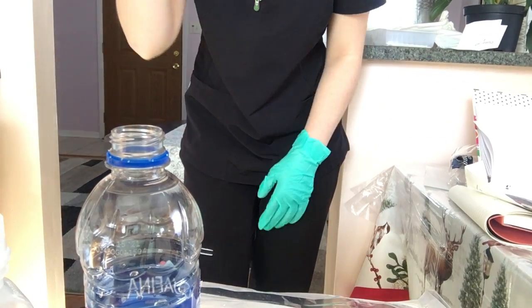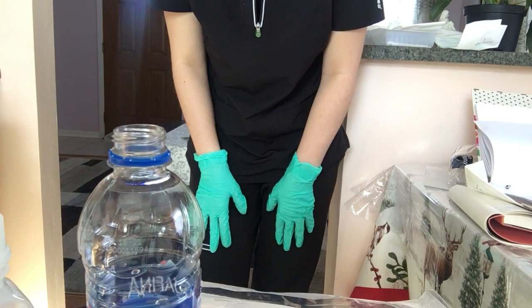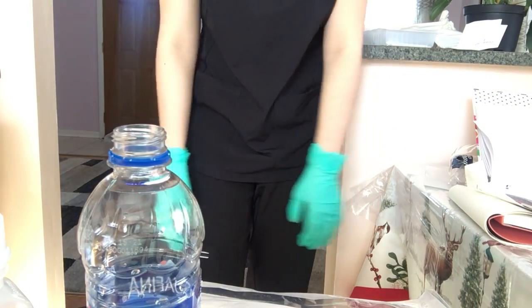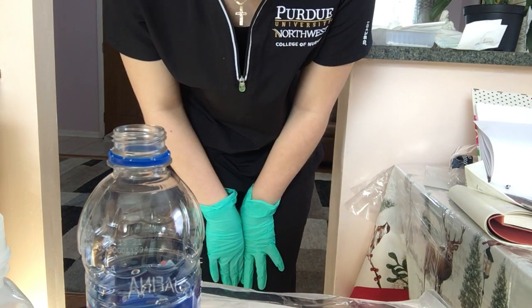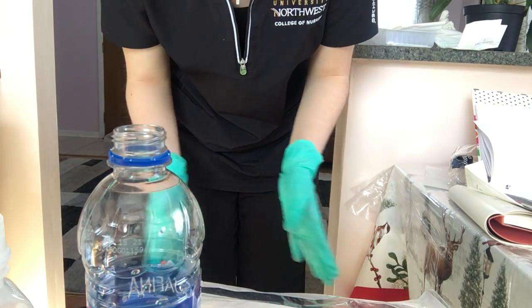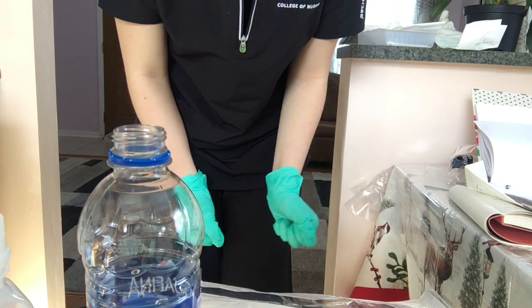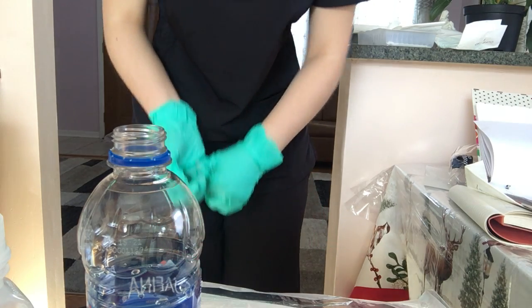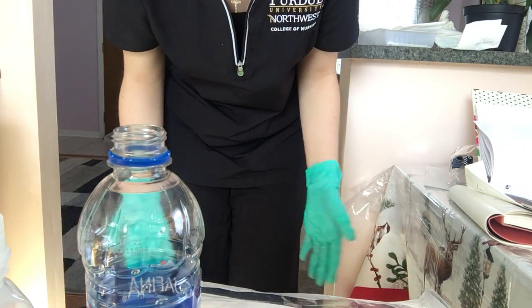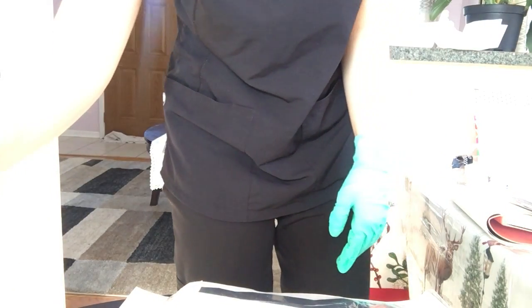Okay, so today in this video I'm going to be showing how to suction a tracheostomy open system. So first what we would do is we would bring the necessary equipment to the bedside stand and over the bedside table, and we would perform hand hygiene and put on our PPE. And we would identify the patient. Since I don't have a human patient to perform this on, I'm going to use this water bottle.